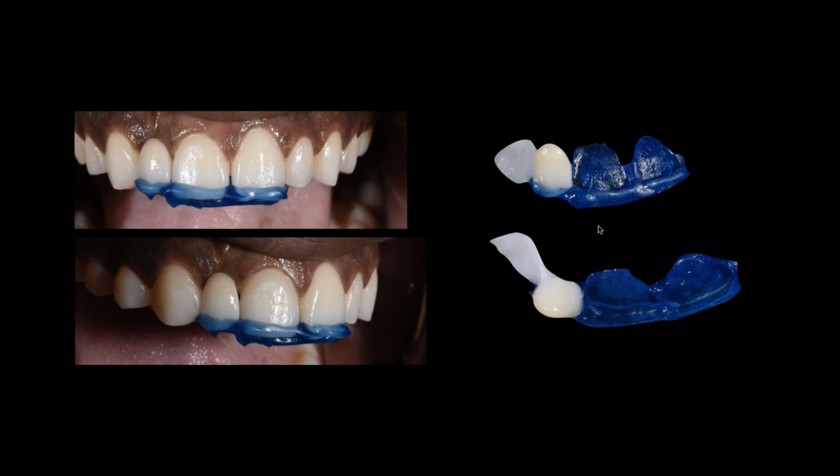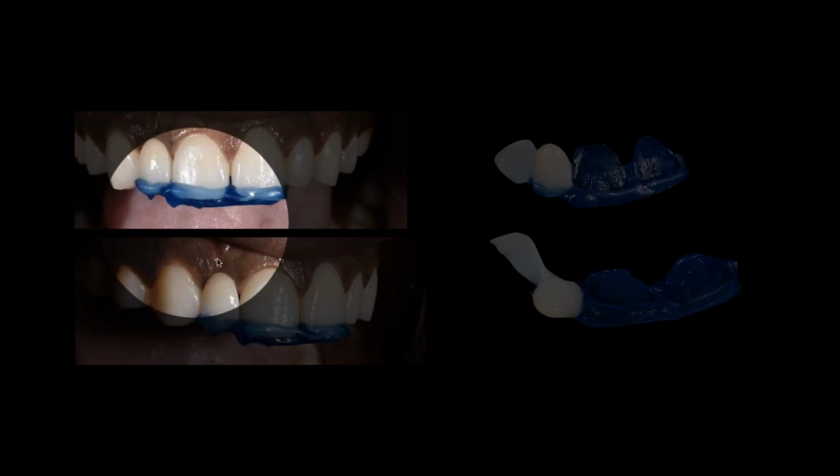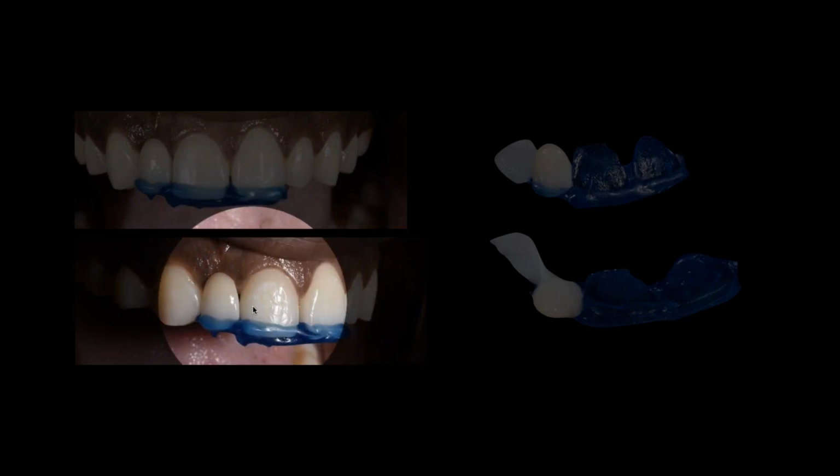But now the challenge we have is when I deliver that final restoration back to her, she has to be prepared to either place a window veneer or make composite herself. Also, I'm going to modify the tissue. So we make these little tiny jigs that guide the placement of this Maryland restoration.